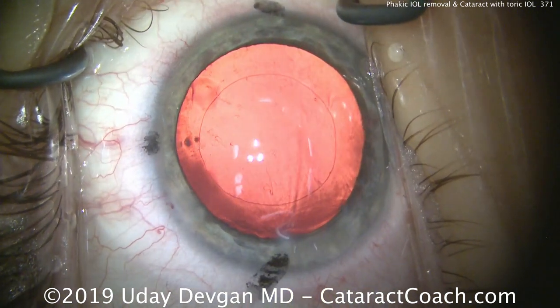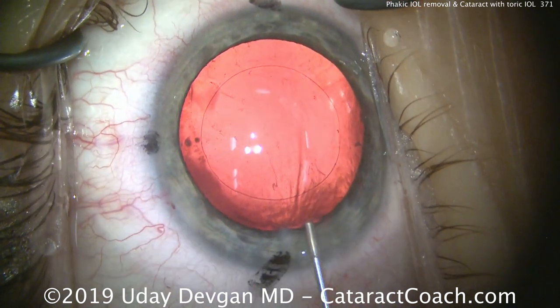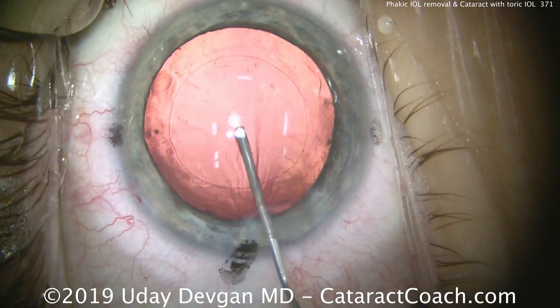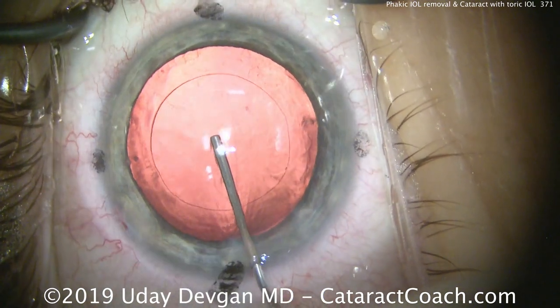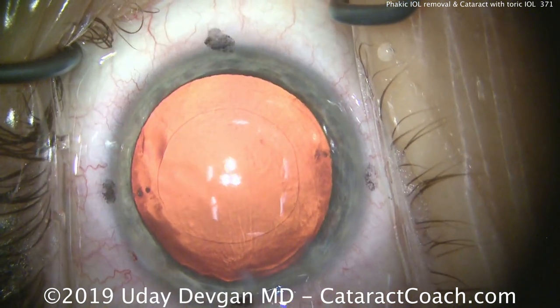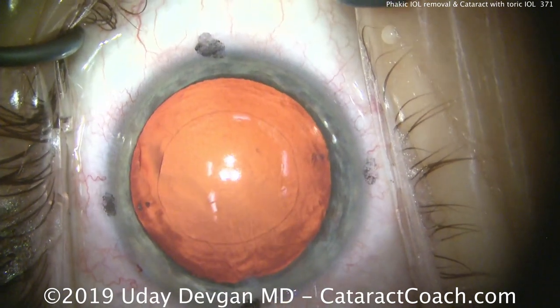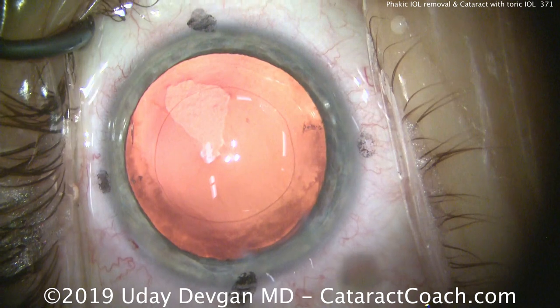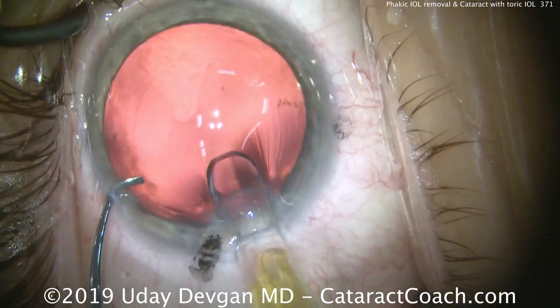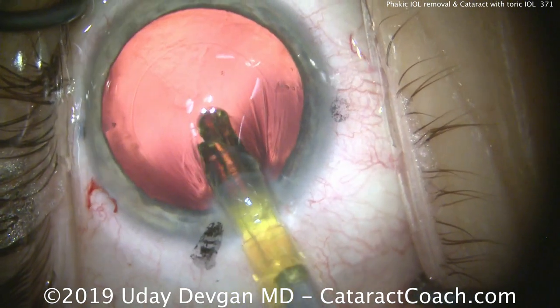Once the capsule is cleaned up, we'll fill the capsular bag with cohesive viscoelastic. You can see we have a beautifully made round capsular rhexis that's just about perfect and very well centered with respect to those Purkinje reflections, with the appropriate diameter. Here comes our IOL — we'll place that in the capsular bag. It's been preloaded by my technician, so nice and easy, we'll deliver the IOL and unfold it in the capsular bag.